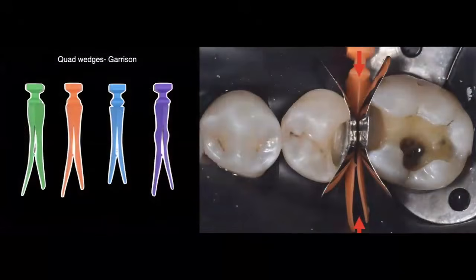Now you are seeing right here that I was not only able to place both of these stiffer interproximal bands, but then I have to choose the right wedge. And the quad matrix, I do like the system. I don't think it's made for every single case out there. I want to put that out there. I don't think that this is the only system that you need to have in your office. You're going to need to have a couple, and I do have a couple of Garrison systems in my office because again, I like this system, but I don't think that it's made for every single case out there as well. So again, it's one more system that I have as an armamentarium in my practice.